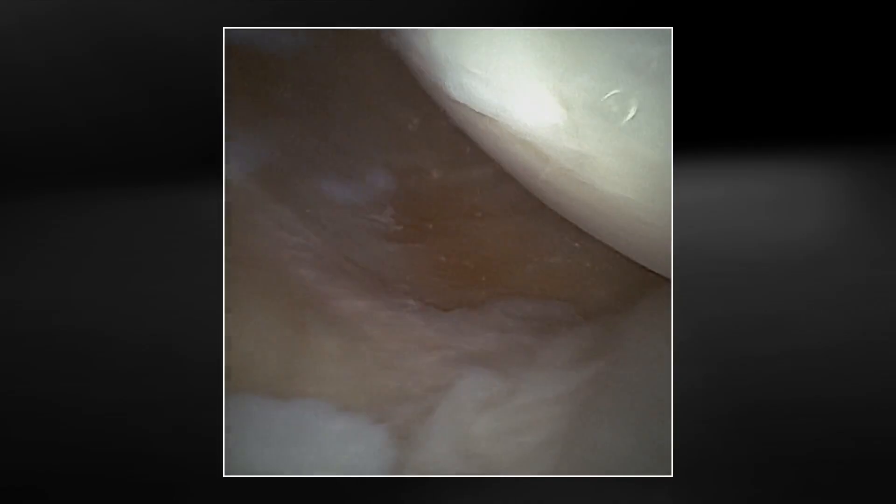Getting into that posterior medial view, we can see the meniscus capsular junction really nicely. We can also use the curved fluid sheath for this if you find that you're not getting a good angle, which can help if you need to perform a root repair, ramp repair, or if you just need to look back there diagnostically for loose bodies.